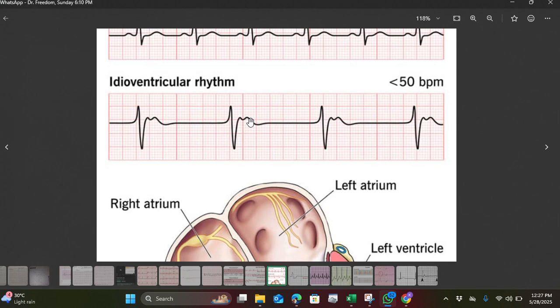Which is why I had to teach you guys what the P wave represents, what the QRS complex represents, and what the T wave represents. P wave is atrial depolarization. QRS complex is what? Ventricular depolarization. The ventricle is pumping out blood, while T wave is what? Ventricular repolarization. So we are looking at what? Q to what? To T, but more of T. That is why something is actually wrong in this T.